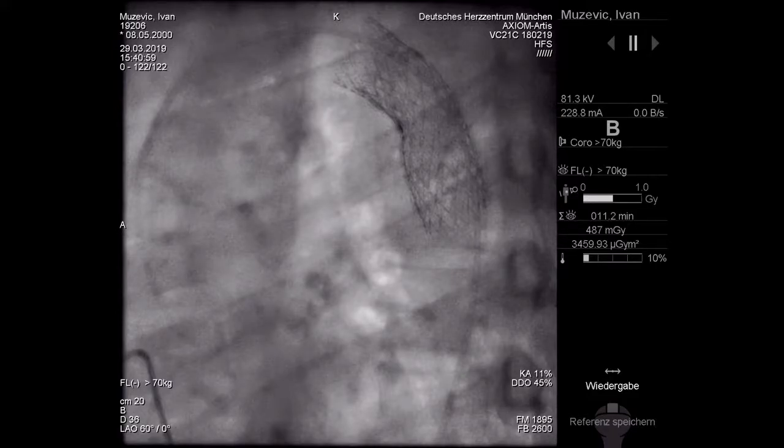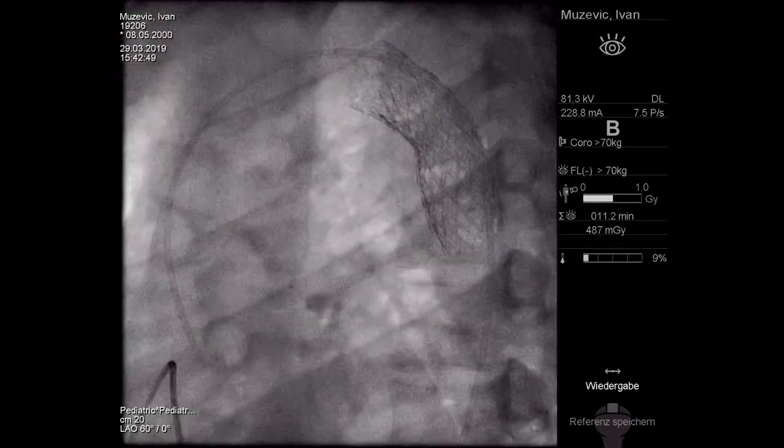Peter, you could use your sheath to find exactly where the obstruction is, and you can work on that. The other point is, if I were to go across the subclavian, I would have a cannula in the left radial before I stented, just in case there's any difficulty going to the subclavian from the aorta. But I think an end hole, the sheath itself is fine, and just do a withdrawal and find out exactly where the gradient is.